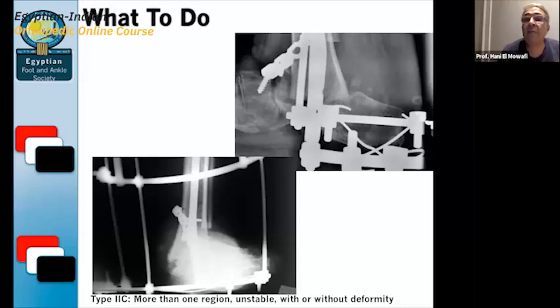With the navicular, we make a decortication and remove the articular surface of the cortex of the tibia, and also remove the articular surface, making just a raw cortical bone surface to get healing. Here is the patient and the follow-up of the same technique. We made a proximal locking but didn't make a distal locking, to allow compression posteriorly, because here the posterior part is completely affected, more in the hindfoot than in the midfoot.